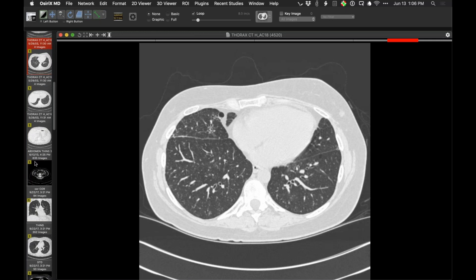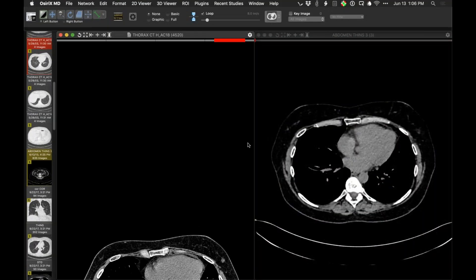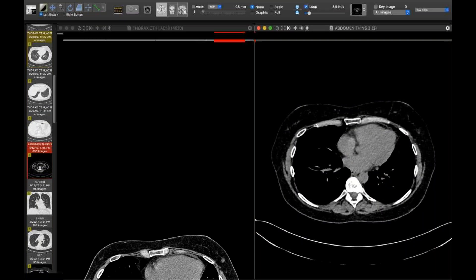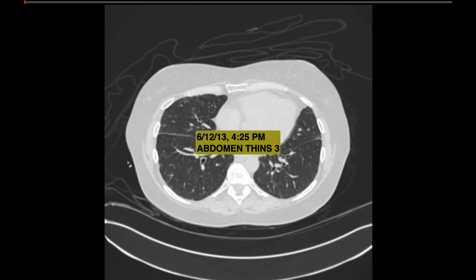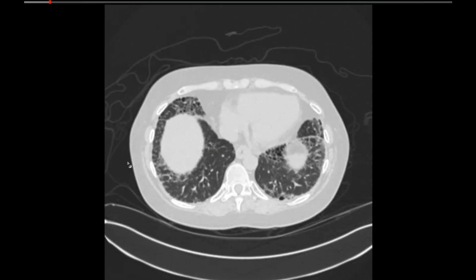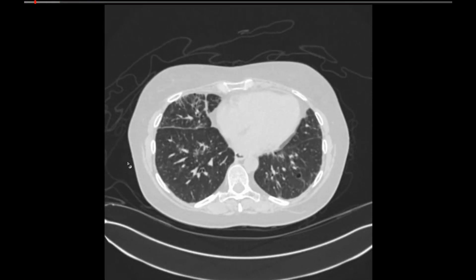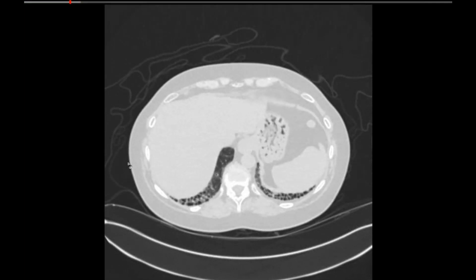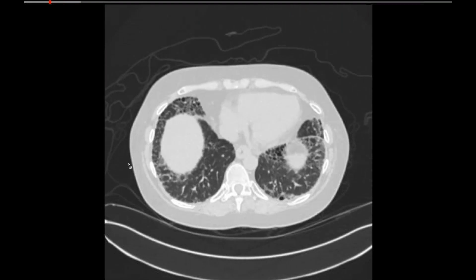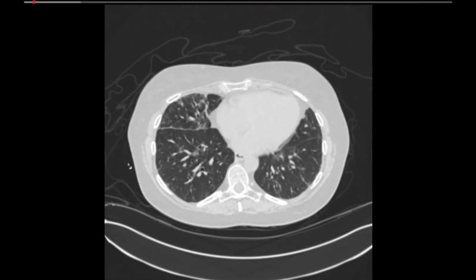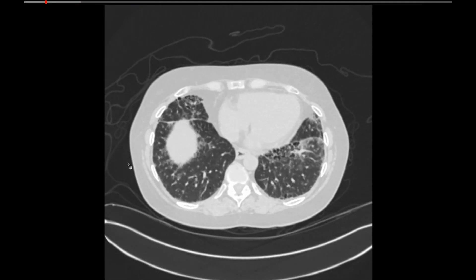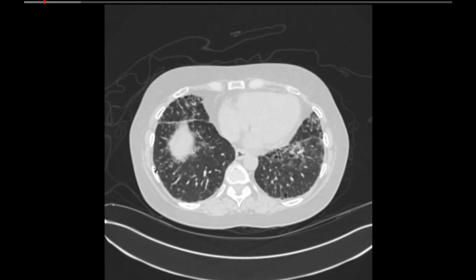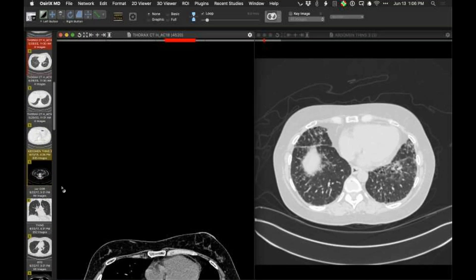Now moving to 2013 — that's 10 years later. We have a lot more abnormality: cystic spaces, a lot of them in the lower lung zones, some subpleural. In addition to that, we also have ill-defined ground glass attenuating opacities in the lung bases.